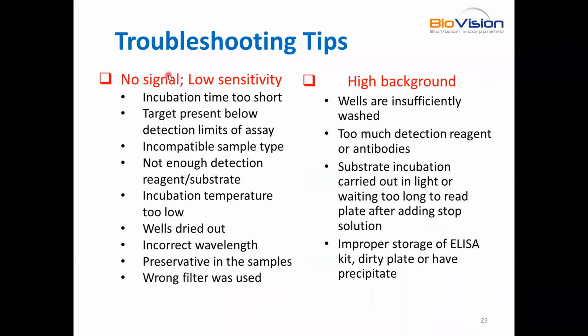Okay, I would like to conclude my presentation with some tips. This is mainly for end users, or those involved in tech support, who frequently get complaints from customers that they are doing their assay but the ELISA kit is not working for them.